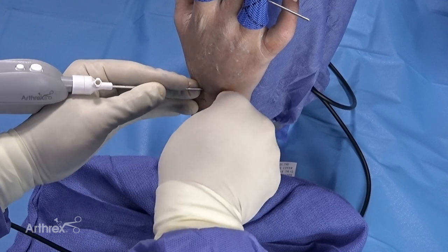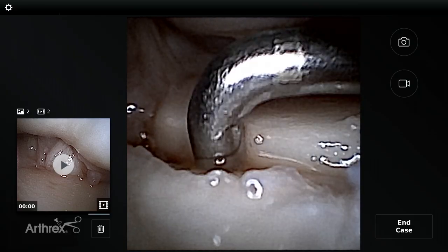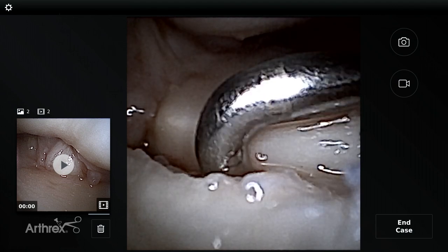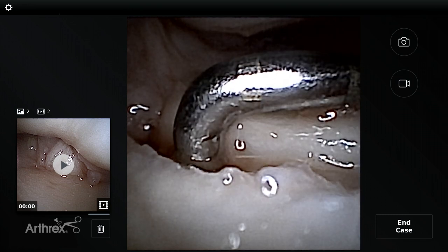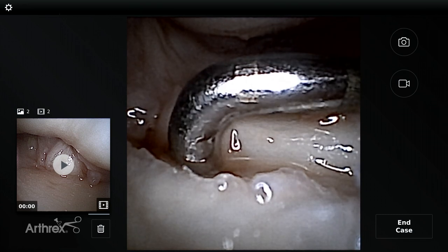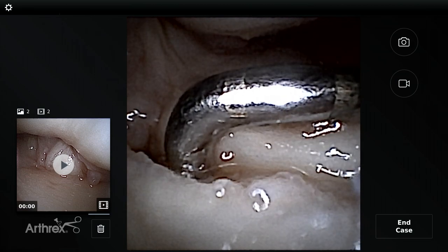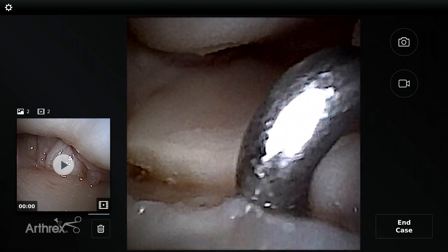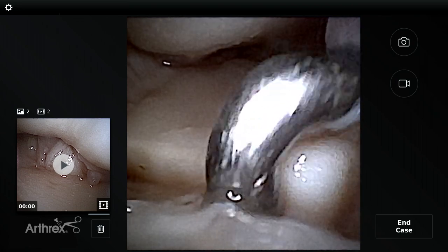I've now introduced the nano probe, and you'll see I'm really pushing between the lunate and triquetrum — and it's stable. I've introduced it onto the volar side. Remember, the LT ligament, like the scapholunate, has both a volar and dorsal component as well as a membranous component. For the LT, the volar is stronger than the dorsal. I'm really stressing it, and now coming to the dorsal side, the nanoscope gives us a 120-degree field of view.